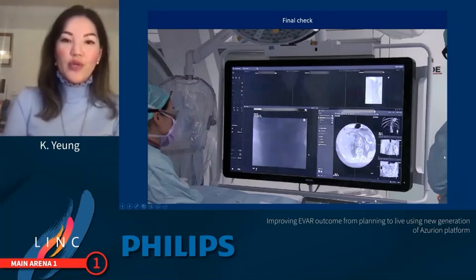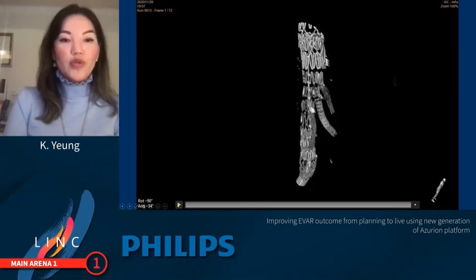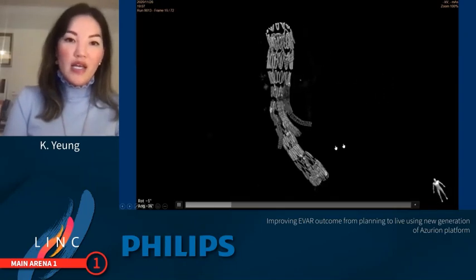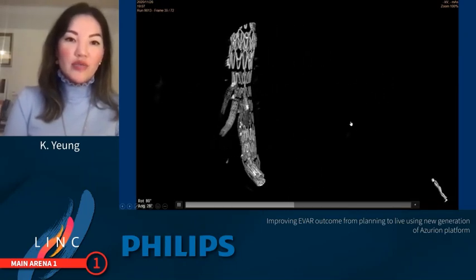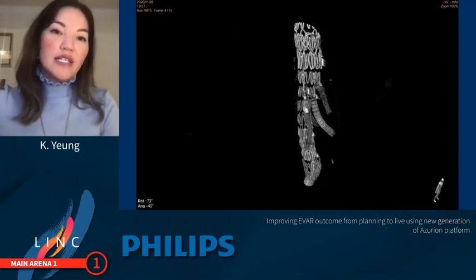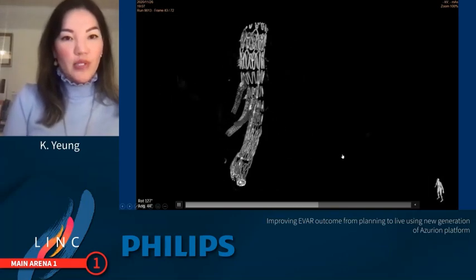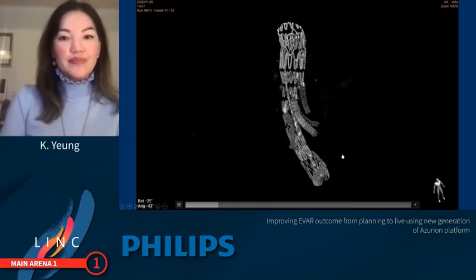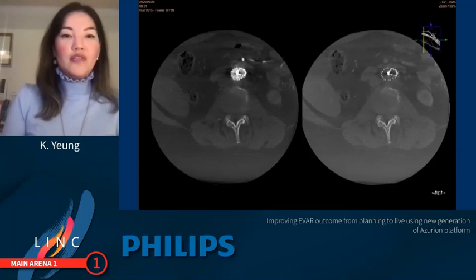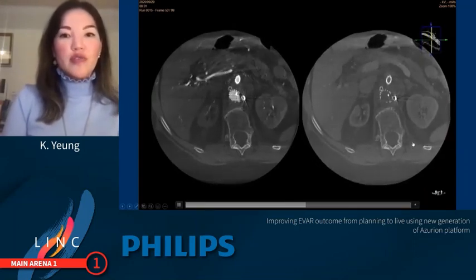You can view your Smart CT that you have made on your table side, but there is also an option for a 3D view, and you can evaluate your stent graft realignment, whether there is any kinking of the stent graft, and how the overlap was. There are 2 phases, like I said before, an arterial phase and a venous phase that we have performed.